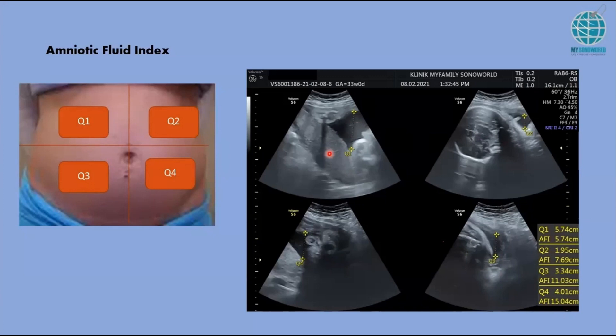It's quite easy. You just have to take the deepest pool without any fetal parts and without any umbilical cord. If you're not sure whether there's any cord, turn on color Doppler — if there's color flow, then the cord is actually there.